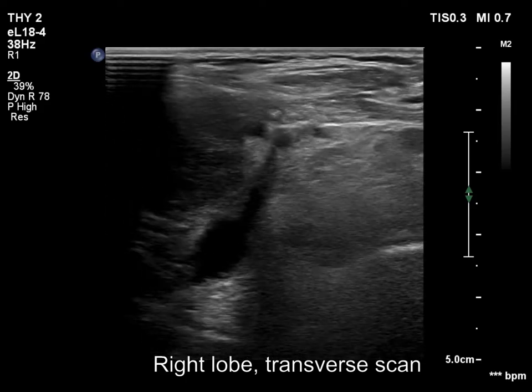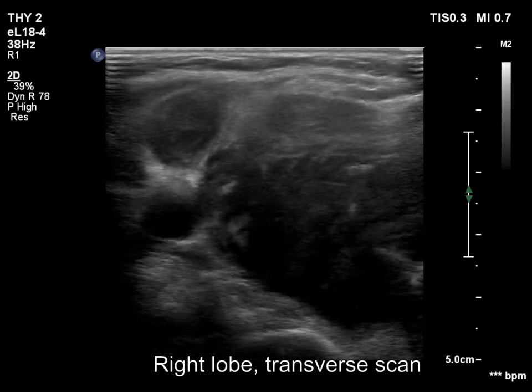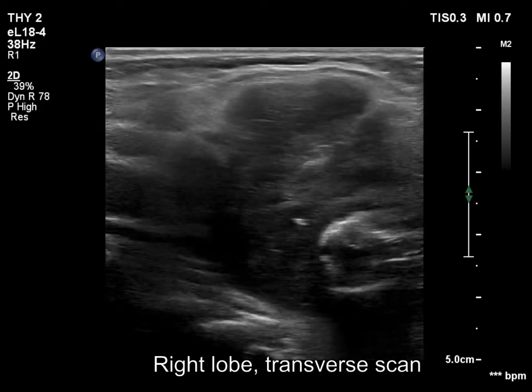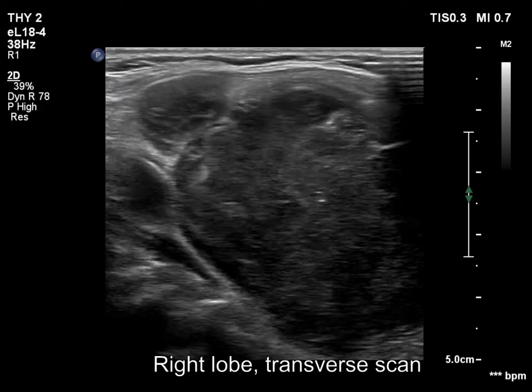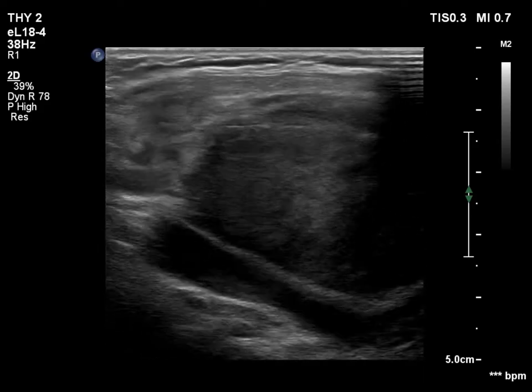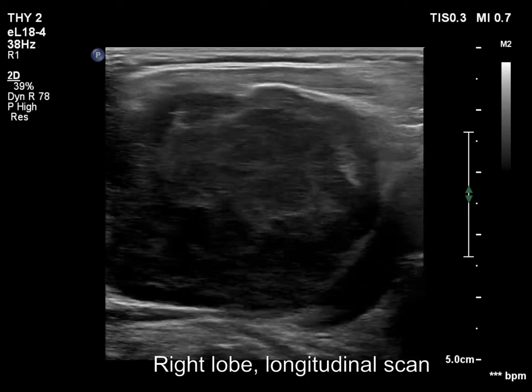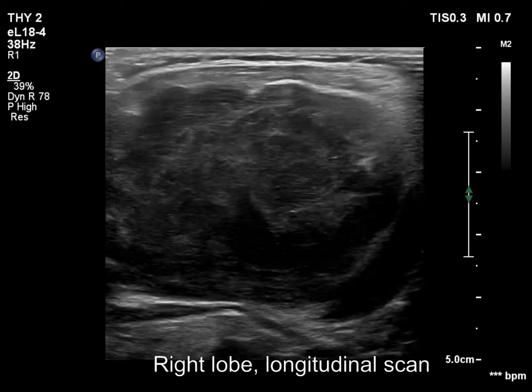The presence of macrocalcification proves that the tumor has evolved in a long-standing goiter. The less hypoechoic, inhomogeneous areas correspond to necrosis.